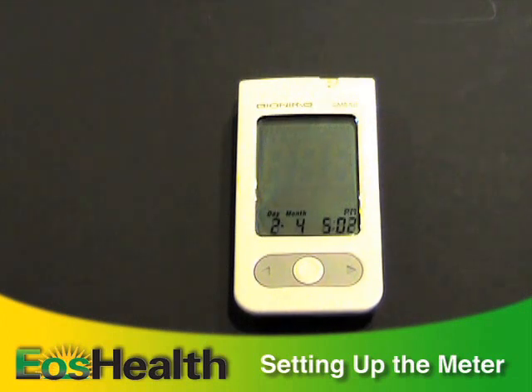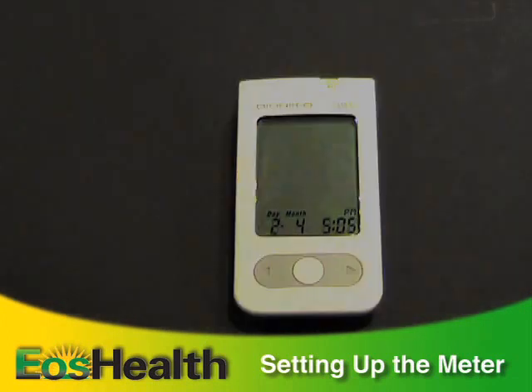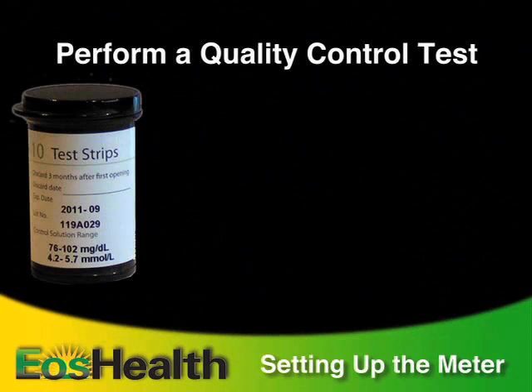The final setting is for unit of measurement — select milligrams per deciliter. After pressing the main button to confirm the measurement unit setting, you'll hear a beep and you've finished the setup.